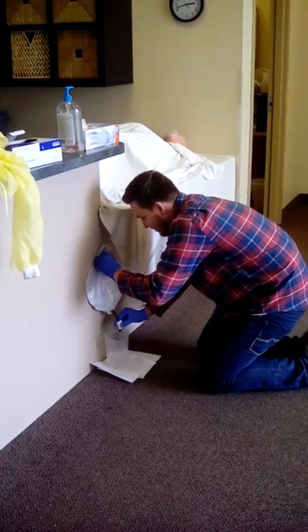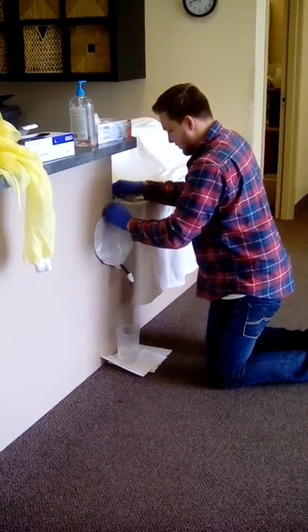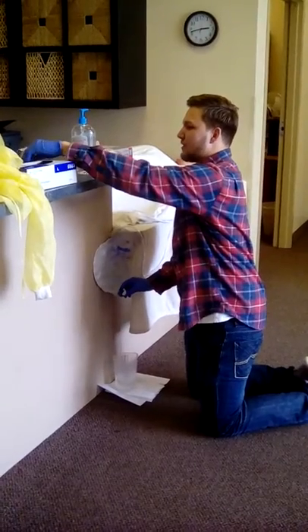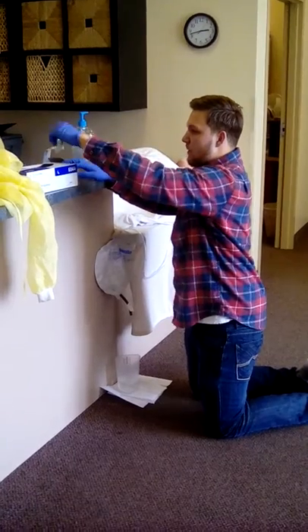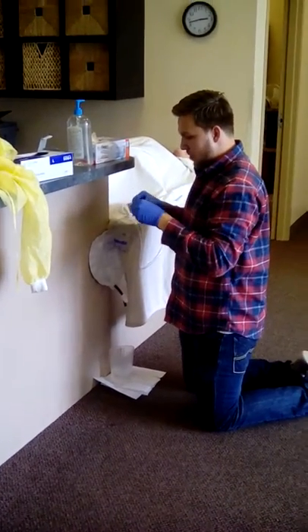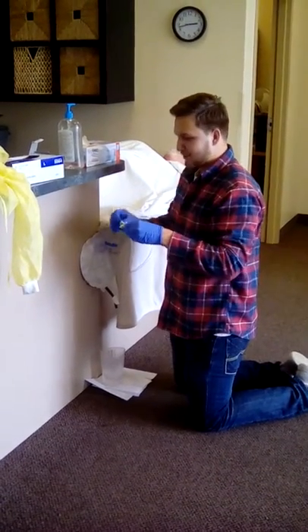I'm not going to be able to do all this. Okay, put this back up here. Get my alcohol wipe. Put my trash in the waste bin, of course.